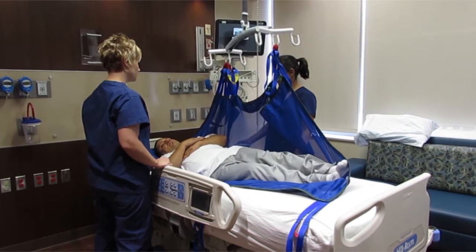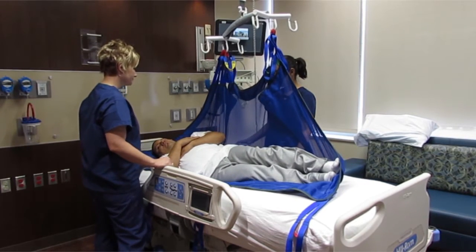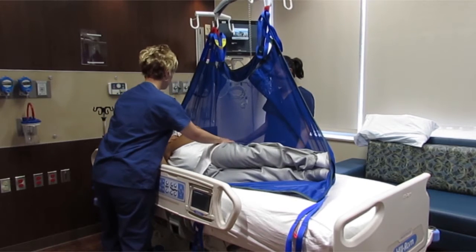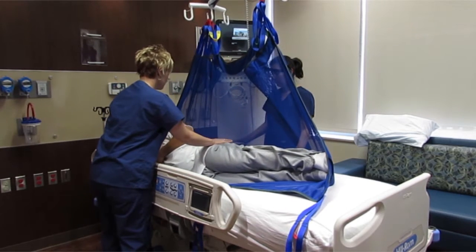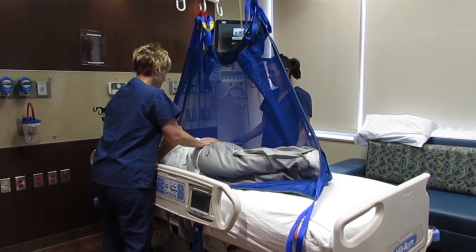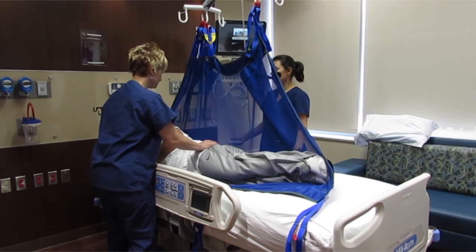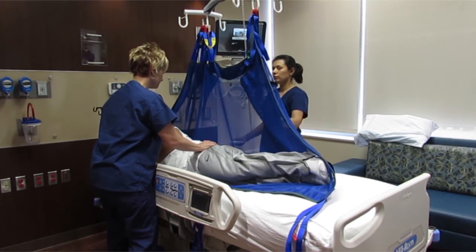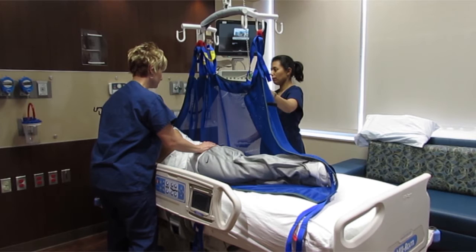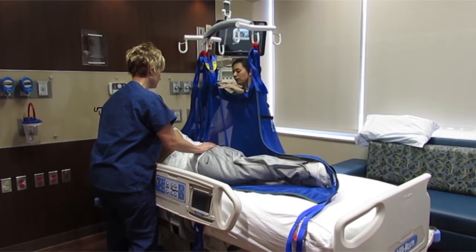By using the sling in the same manner, a caregiver can also assess the patient's skin by bringing the patient over more into the side lying position, being careful not to roll the patient too far over. Then with the help of a second caregiver holding the patient in the side lying position, lower the sling down and assess the skin.